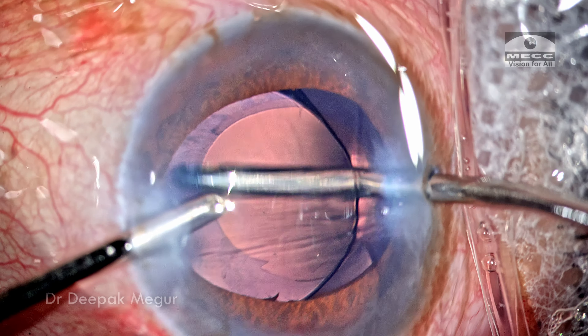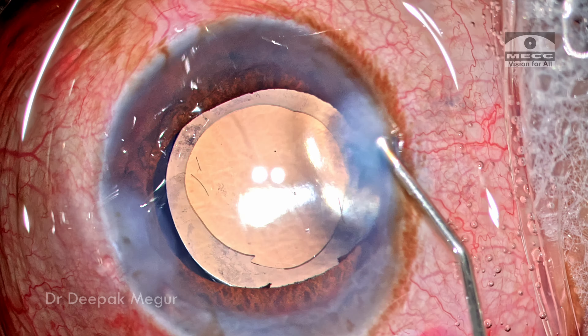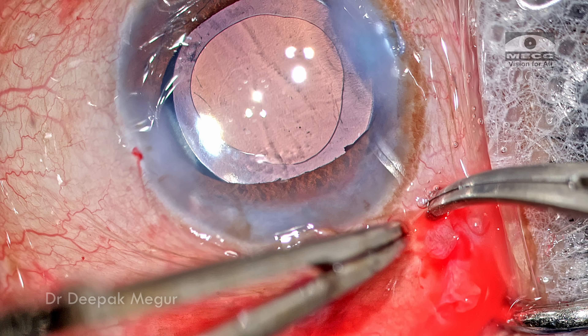Once the capsule bag is nice and clean, it's time to close. The side ports are hydrated with BSS and the conjunctival flap is closed with glue.